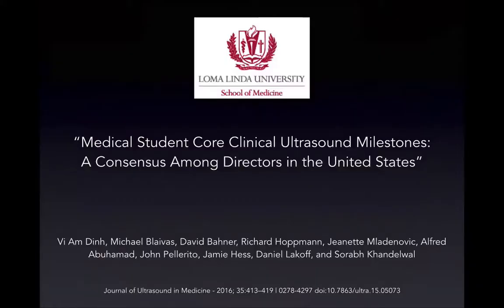And interesting literature out there just got published, where there's a consensus among ultrasound directors regarding the milestones that every medical student should know regardless of specialty. Really interesting. If you think about it, you are going to be exposed to ultrasound one way or the other, because you're ordering a test, because you're trying to interpret a test. So interesting stuff there. I was lucky to be a contributing author on this paper, so pretty cool.